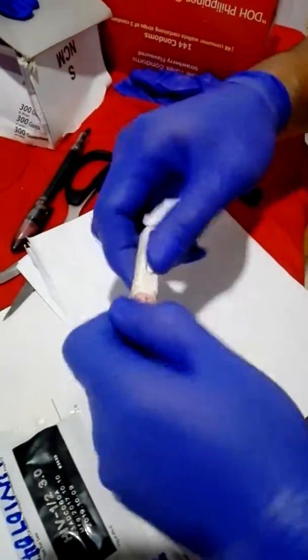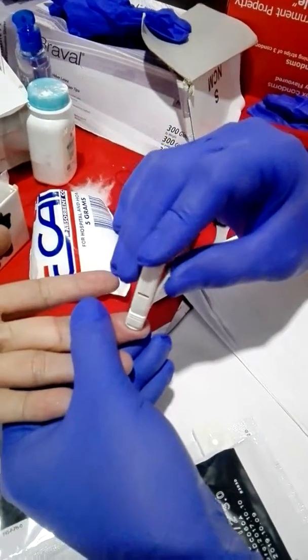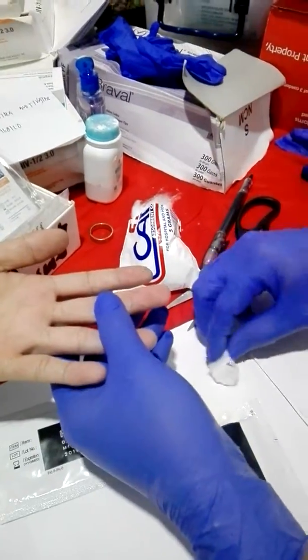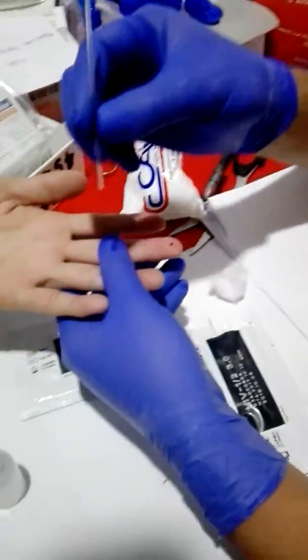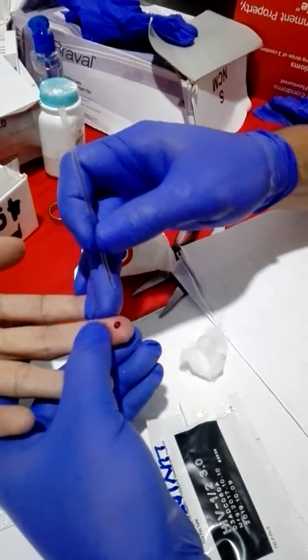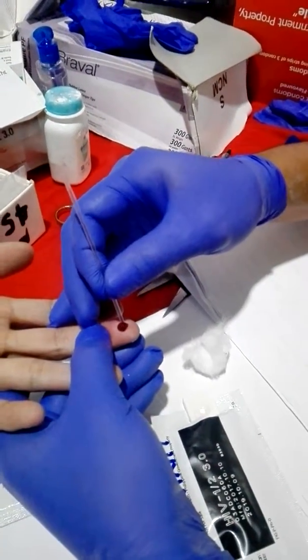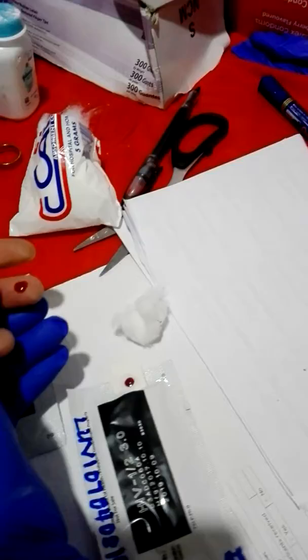And open the lancet and prick. Do not be afraid, ladies and gentlemen, because it's somehow like a bite of an ant. It's not really painful. It's just a very small one. So we now use the capillary tube, responsible for getting the specimen, sucking the blood to transfer it to the HIV medical kit. There you go. Transferring it. All right, and it's done.